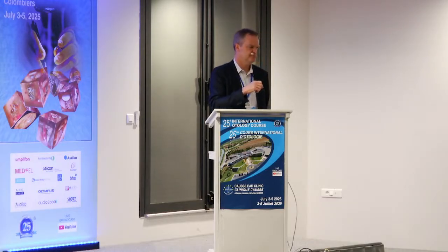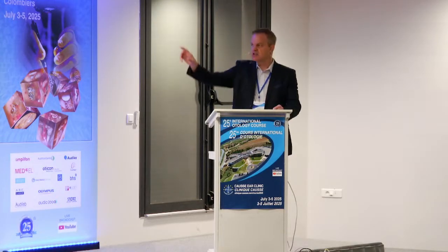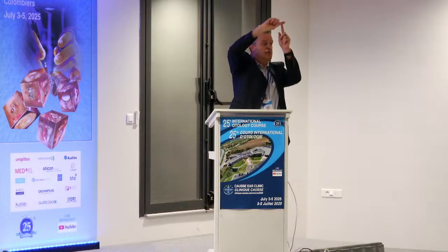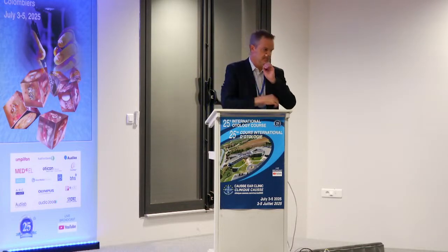Because with that congenital case you showed, yes, it didn't look right. Oh, sorry, you know what happened there? The incus was in two places removed, two places loose. So it was like an incus, stapes, and then a middle piece that was loose like this. That was actually removed, with the mucosa slightly moved. It was glued with one nylon strut down. Sorry, I should have shown you that. No, that's great, just an observation.